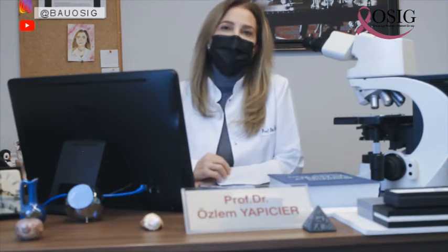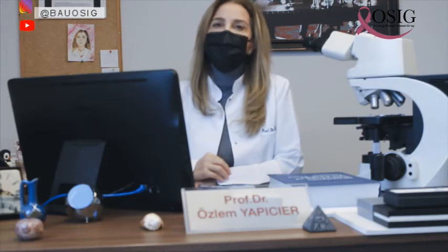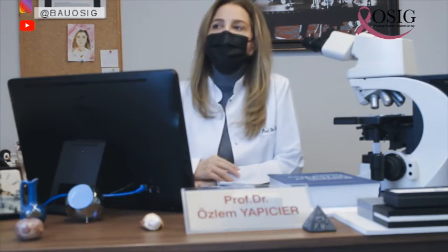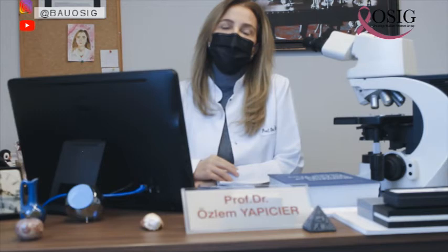The cells should be evaluated for any abnormal epithelial changes, and we use general histomorphologic cytologic criteria in terms of nuclear and cytoplasmic changes in the cells to determine the abnormality of cells, to determine the cancer cells.